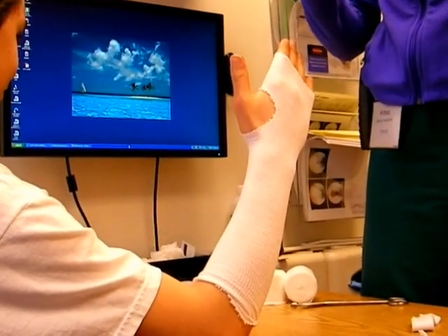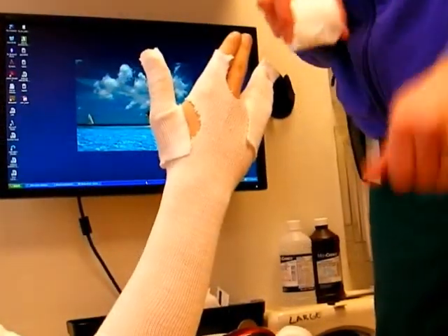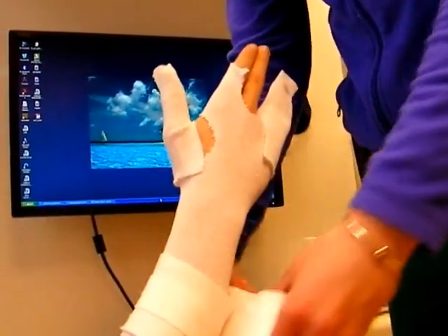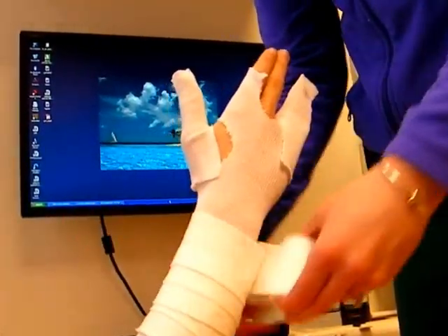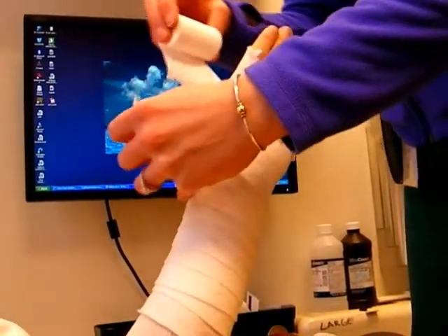The lightweight cotton fabric being applied is called stockinette, and it makes the skin a lot less itchy for the patient. The cotton roll being applied here is called web roll, and it is a form of padding which helps to make the cast much more comfortable for the patient.